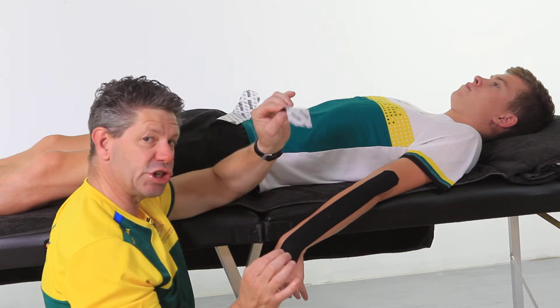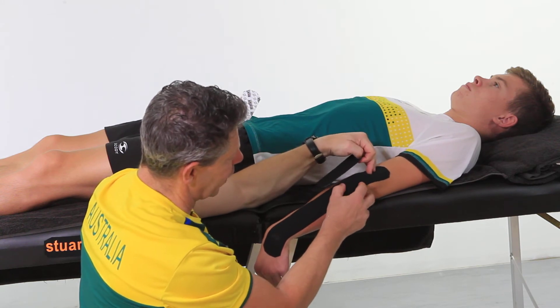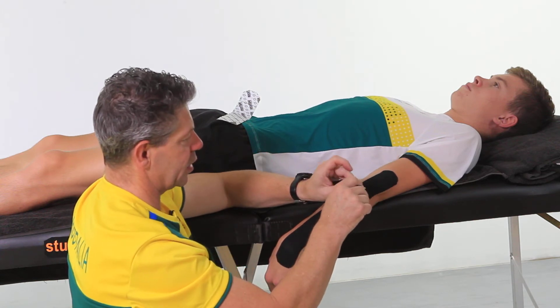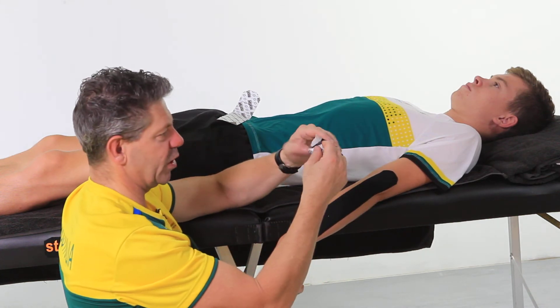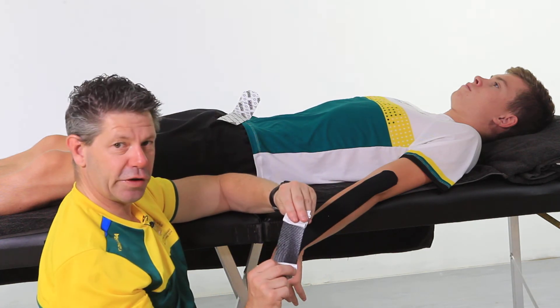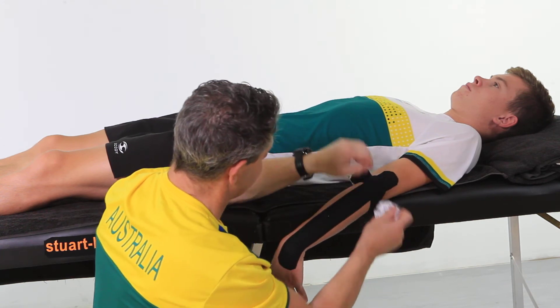Come with your decompression now. That's going to come right across where the pain is — wherever they feel that pain is where you're going to decompress. The easiest way to do that is getting them to make a fist and then push up against you, and you should pretty much find that you can locate the pain quite simply. Peel your backing tape and place straight over that point.